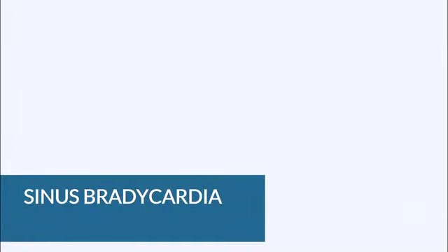In this lesson, we're going to talk about the characteristics of sinus bradycardia and most common symptoms, some of the possible causes, treatment, and nursing interventions. We're also going to break down each of the steps to learn how to identify it on an EKG.